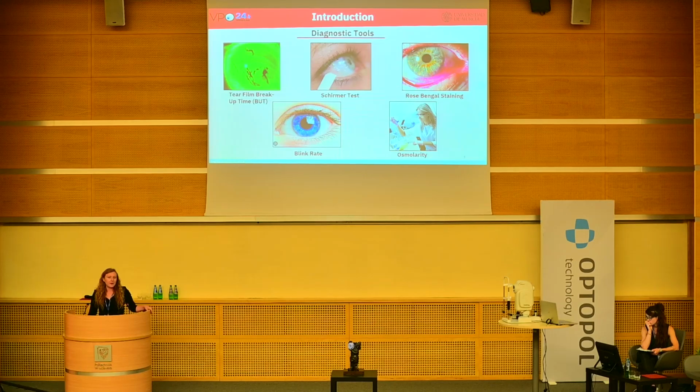A little bit about the diagnostic tools of dry eye disease. Current diagnostic tools for dry eye disease remain a challenge due to a number of reasons, like the variability in symptoms and the lack of a unified diagnostic approach. Current methods can be invasive and uncomfortable, highlighting the need for an innovative and non-invasive diagnostic tool.